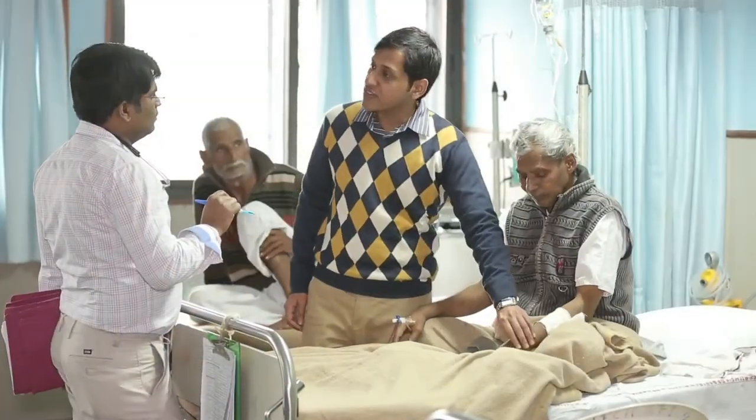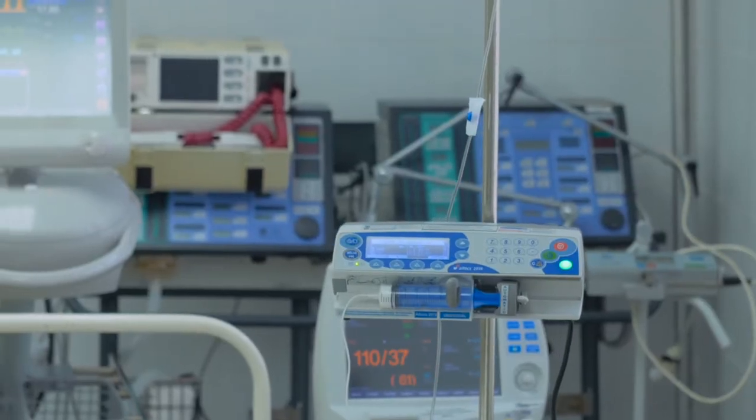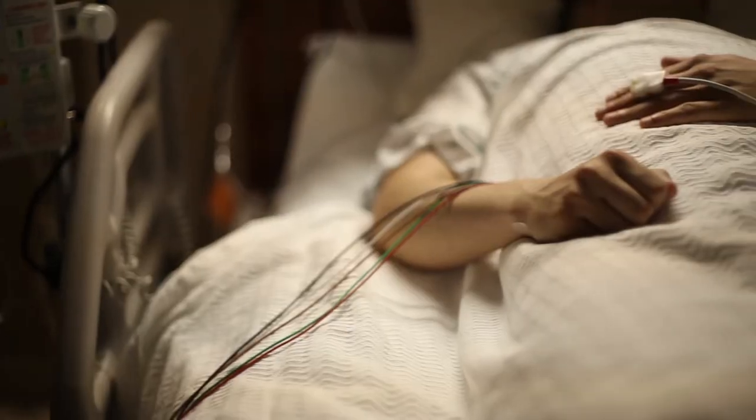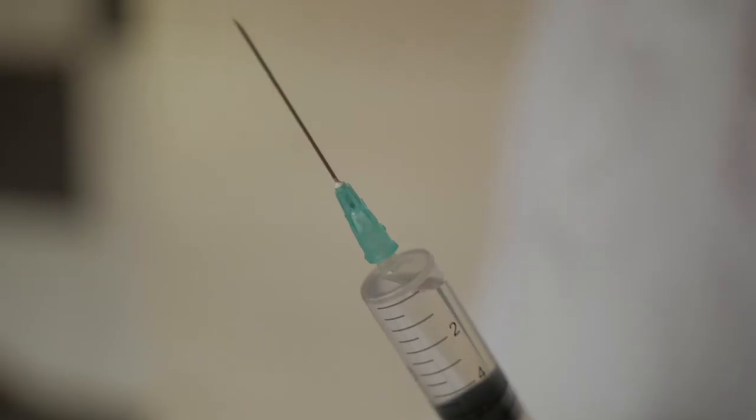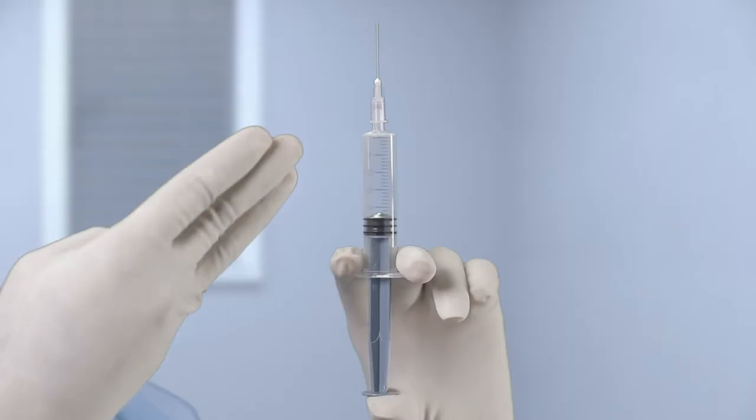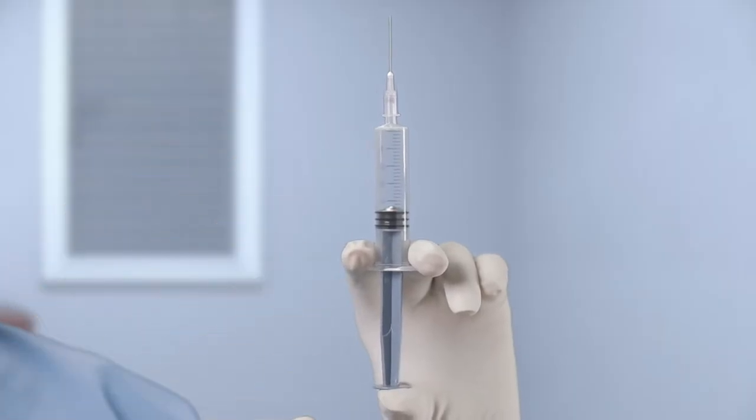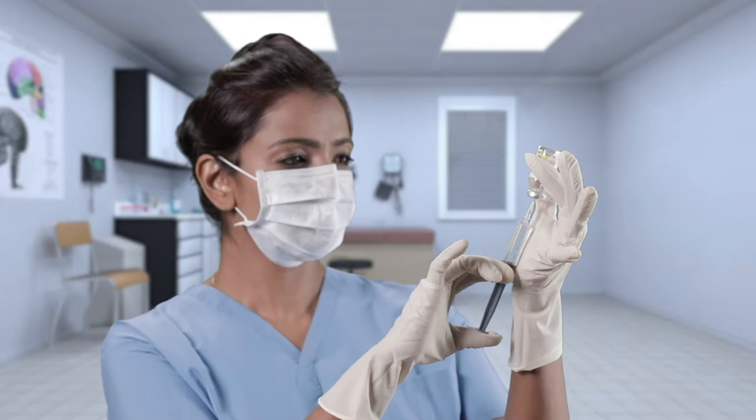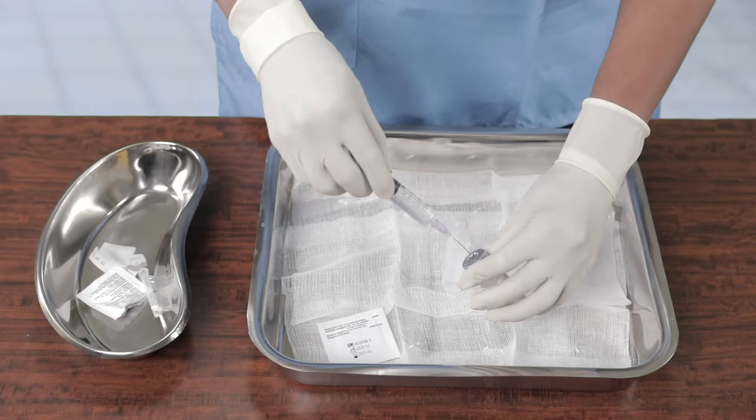In the battle between disease and doctors, an ICU is one place where safety is of paramount importance. It would be detrimental if at any point a slip-up happens because of the syringe being used, but it can potentially happen with a luer slip syringe.